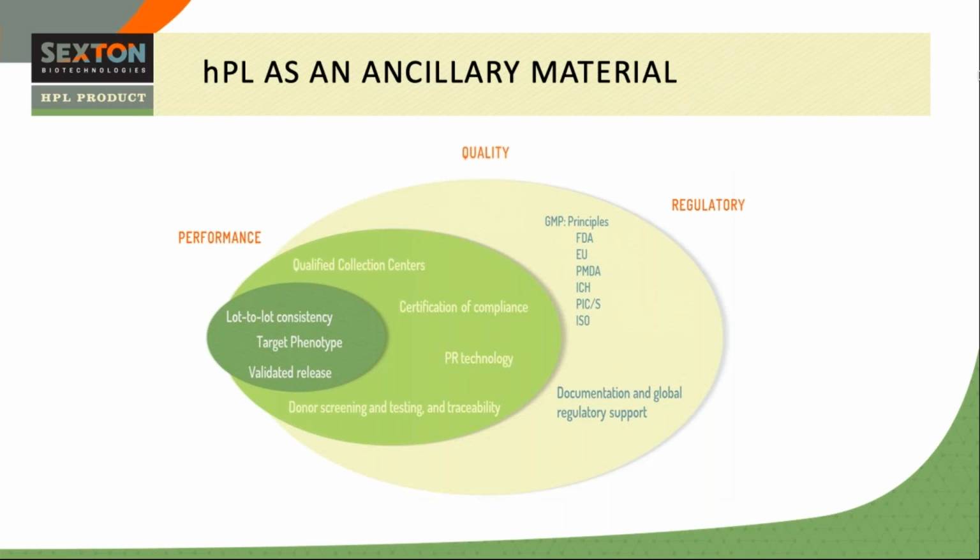As previously, it's key to consider HPL, like all biological raw materials, as a product category, and different preparation methods could have a significant impact, not just on cell expansion rates, but also on phenotype and efficacy of the final product.